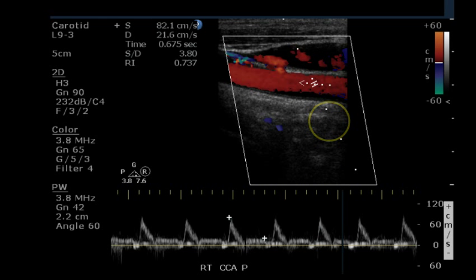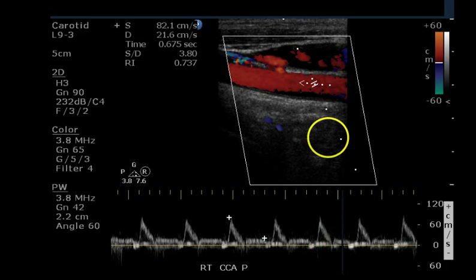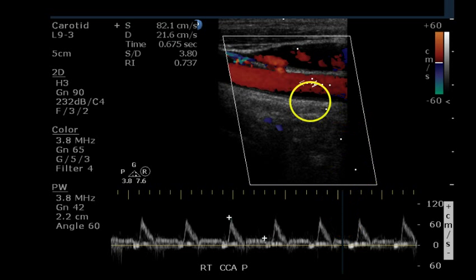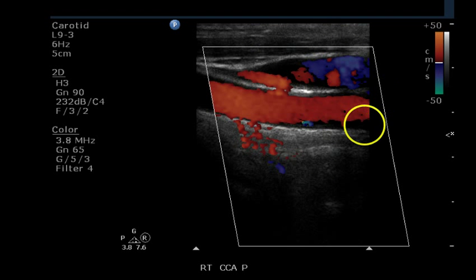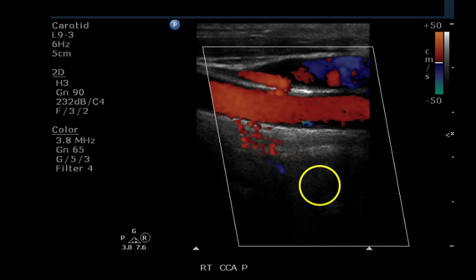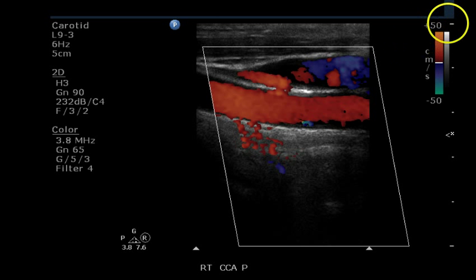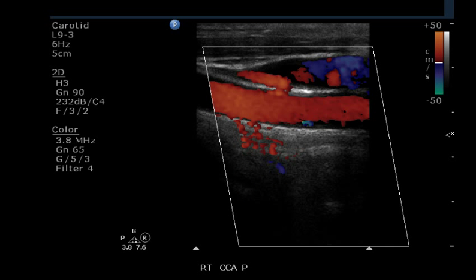It appears that the lumen is largely filled with color Doppler. This line demonstrates when the updating occurred — during systole or during diastole. It's always advisable to freeze during systole, and this would probably fill in if that had been the case. This is color Doppler of the carotid artery with the jugular vein above. This is color bleeding due to a high color gain setting, with a fairly high PRF value for the color box. If the PRF were reduced, we'd have brighter colors and wouldn't need to push our color Doppler gain up as much.